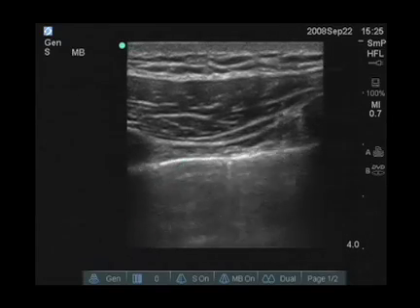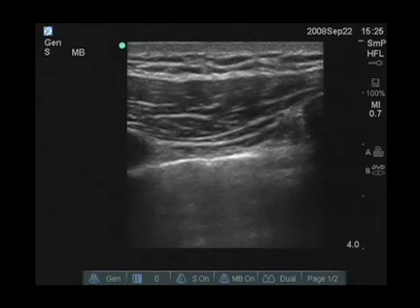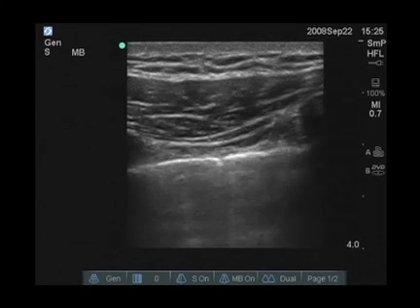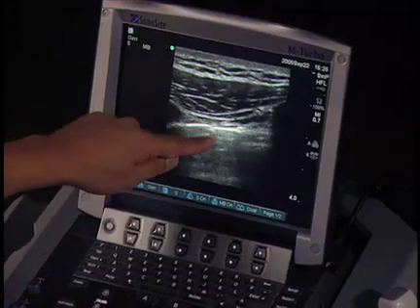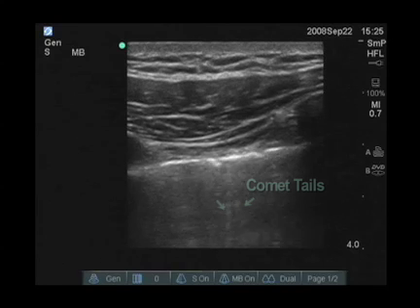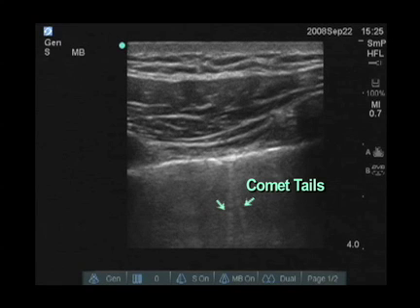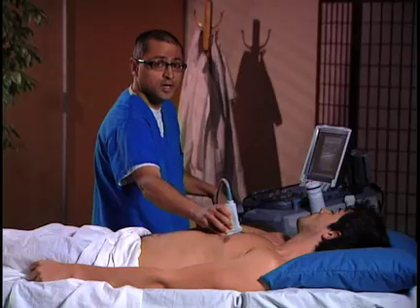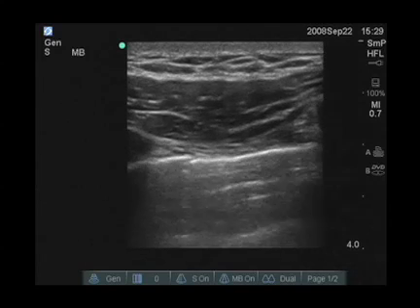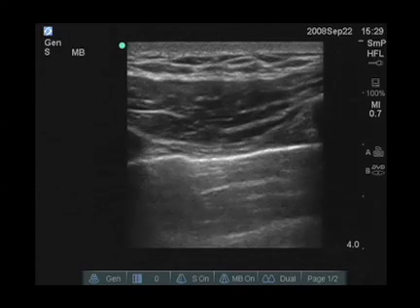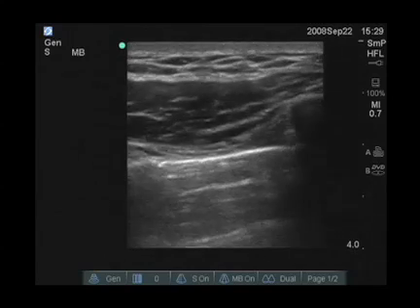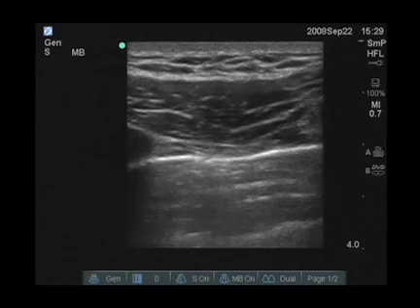As he takes a breath, we see shimmering — these are the two surfaces of the lung, the visceral surface and the parietal surface rubbing together. We also see little tiny white comet tail lines, which also show that both surfaces are touching together. If you see this pattern, you have reliably excluded a pneumothorax. You can see in this model that we can easily see a rib anteriorly, another one more inferiorly, and the pleural line easily in the middle.